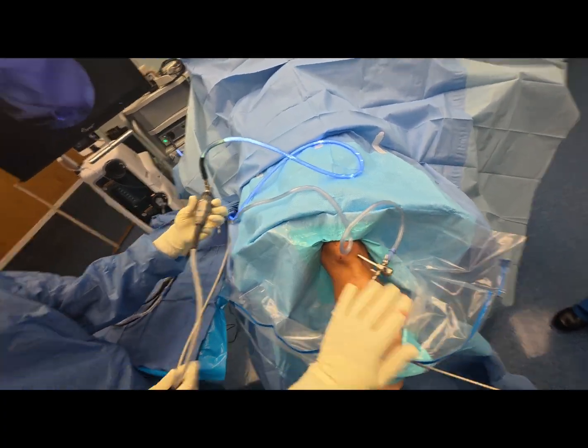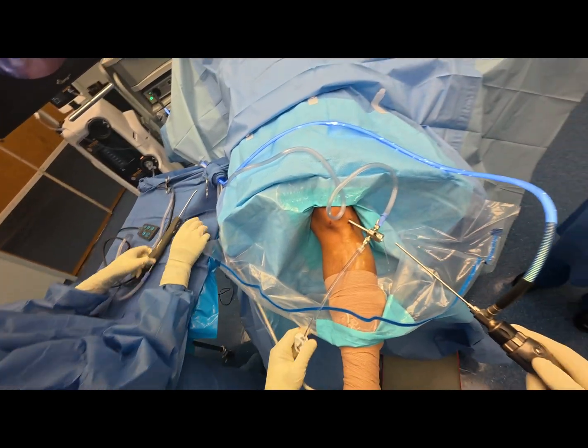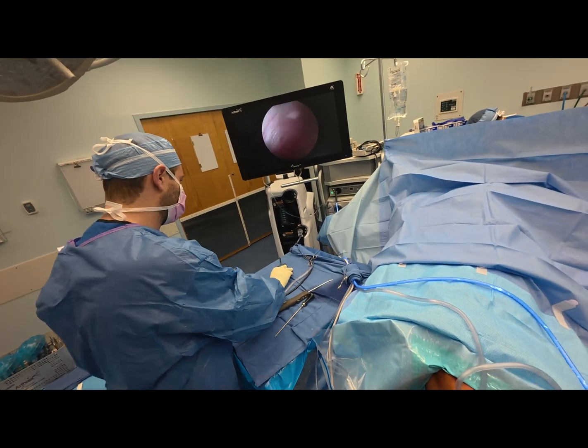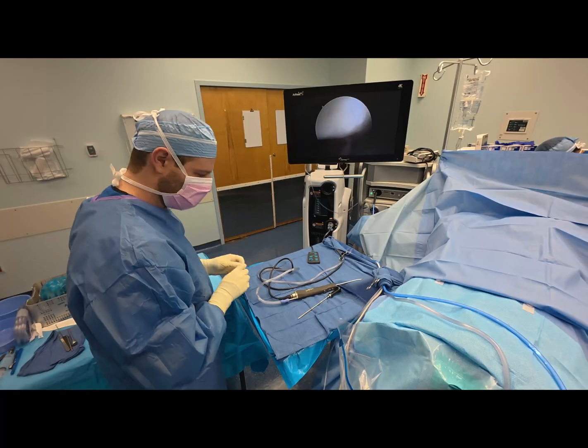42 for start time? Correct. Thank you. Get that water running. Clear out the joint. And start our diagnostic arthroscopy.